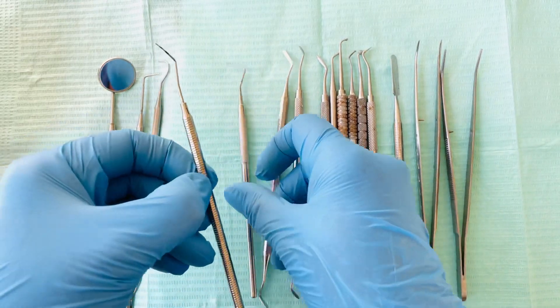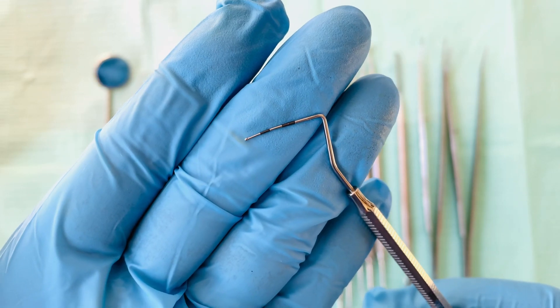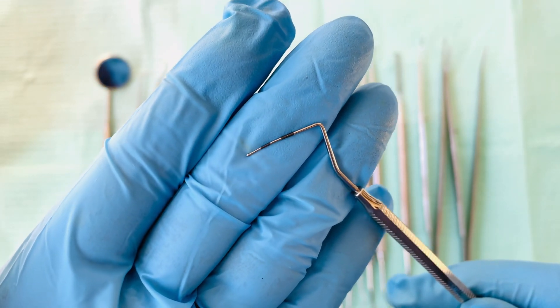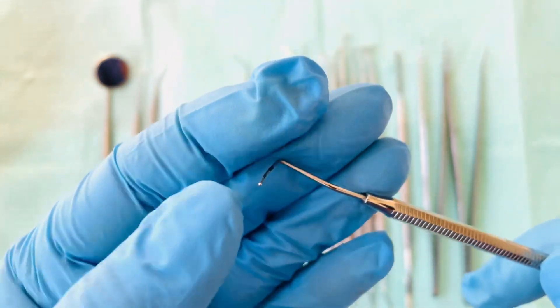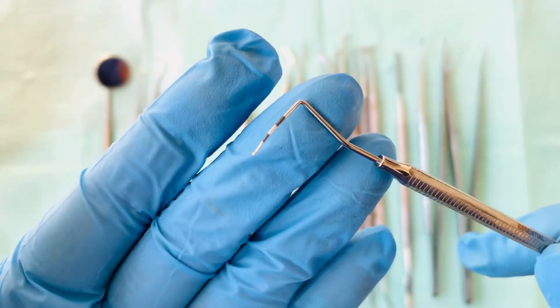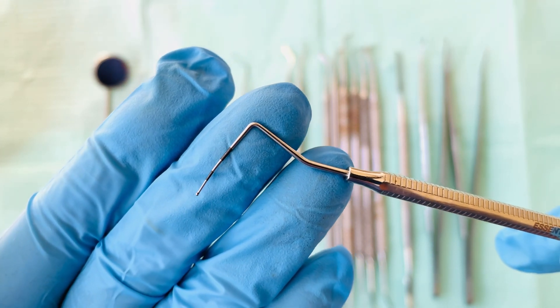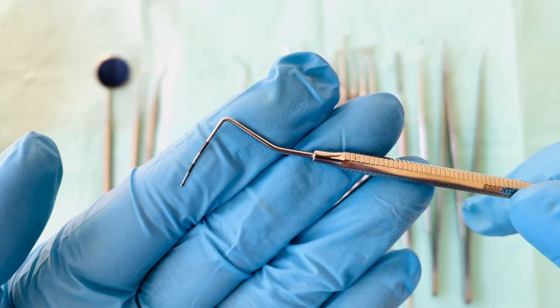Next one is called the BPE probe, or Basic Periodontal Examination probe. The end has a 0.5 millimeter width. This is used to do a quick check of the periodontal tissue.